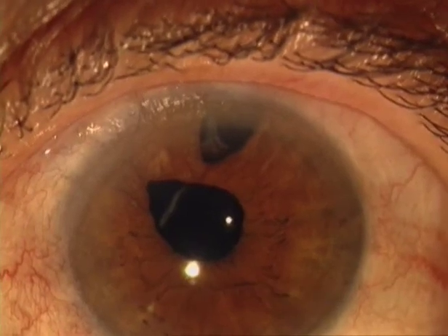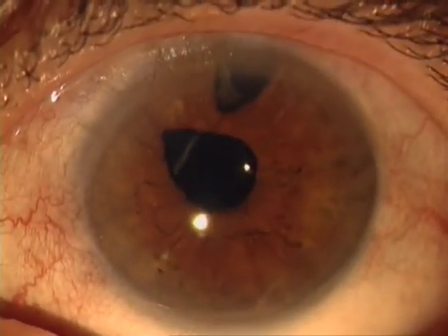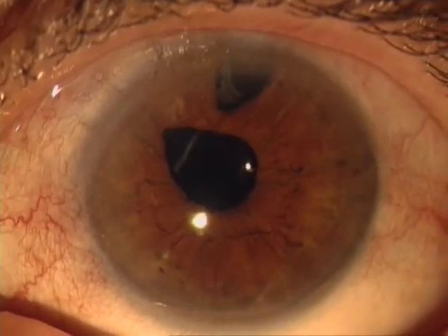Surgical damage may be difficult to detect, such as here after an attempt to remove vitreous from the wound. We see just a faint line in retroillumination, which is the border of a defect in Descemet's membrane. This border is made visible only by very careful focusing, because no crests have been formed.